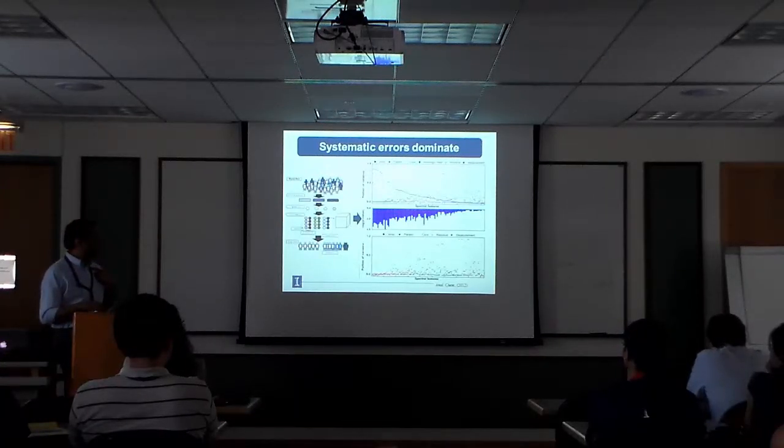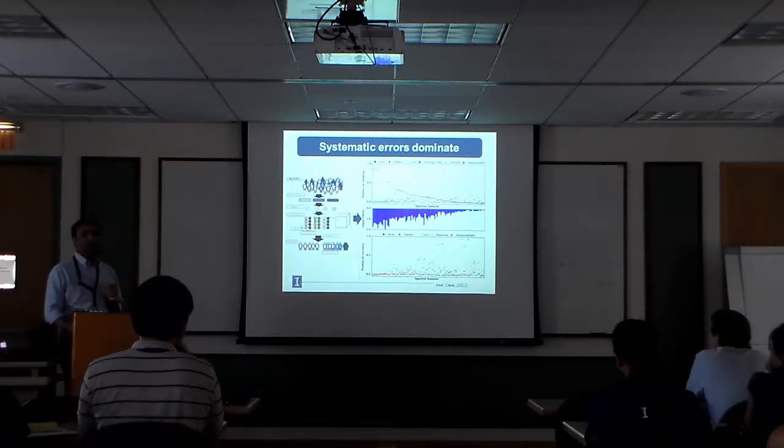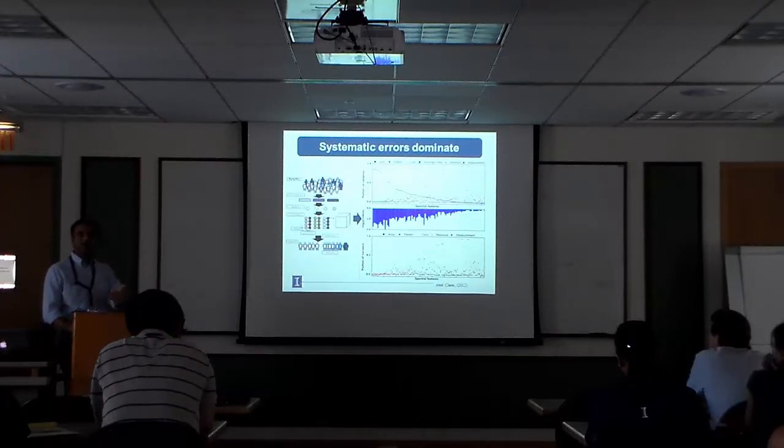What is this error that is starting to dominate after a certain point? And it turns out in this particular case at about 20 or so, you start getting this residual in the ANOVA model, right? This is the unexplained error that we found in the ANOVA model that doesn't allow us to go beyond about 30 features in the infrared data.